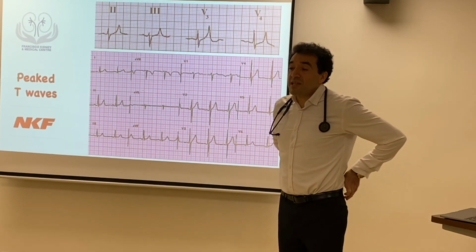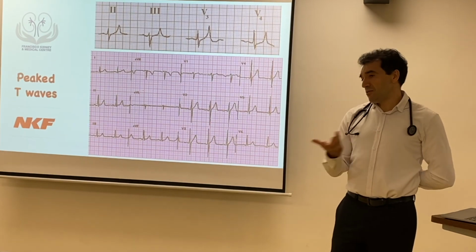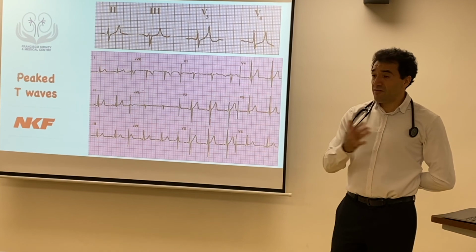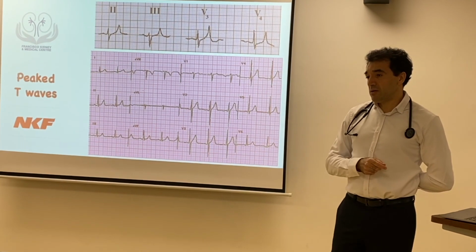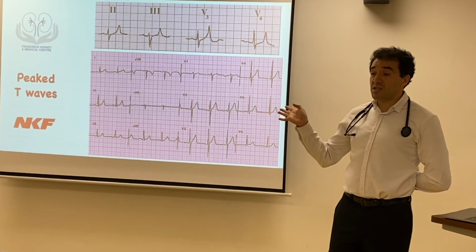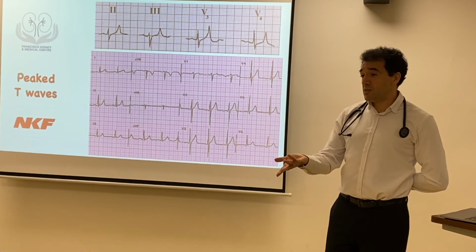So I don't have a precise answer to that, but these discrepancies can happen because it's a different method to read the same thing and probably was read at different times, no? But I would trust the ECG probably much better, no? Yeah, for that. And then the doctor told you, because the ECG is okay, you can proceed, no? And you proceeded, and the patient went okay, correct?